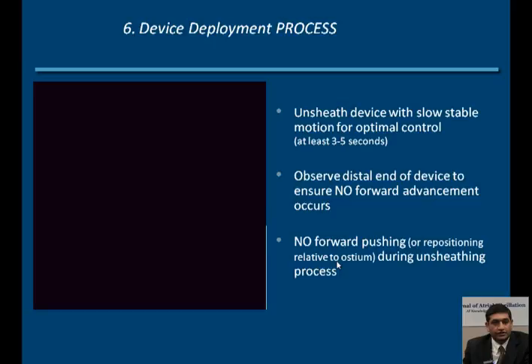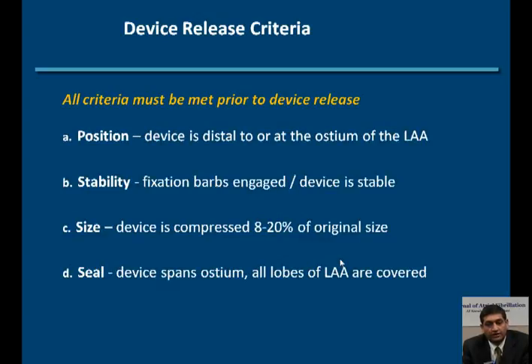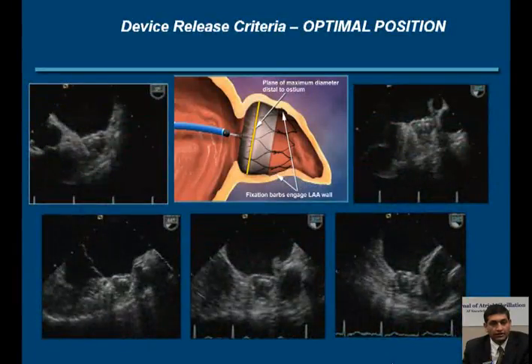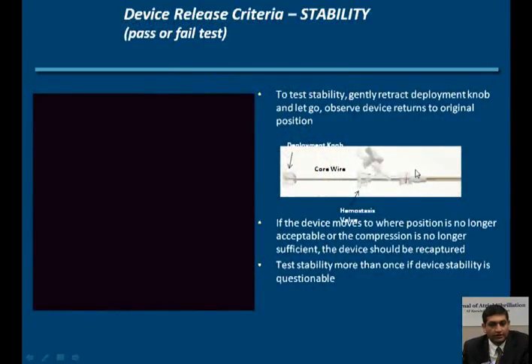And again, this shows the events during the procedure implant. The pericardial effusion rate was 4.5% in the implanted group, ischemic stroke 1.1%, 0.2% risk of device embolization, and major bleeding was again 1.1%. Total event rates were 34, which were 7.3% of the implanted device. Events after 7 days were no different in the two groups, WATCHMAN and the control. If you look at the all-cause mortality, there was a 30% lower relative risk in the WATCHMAN group when we look at the current data set.